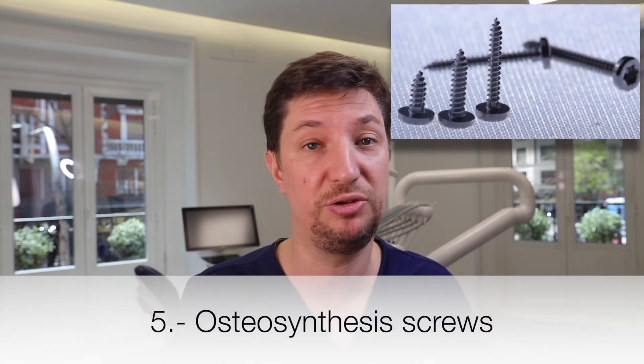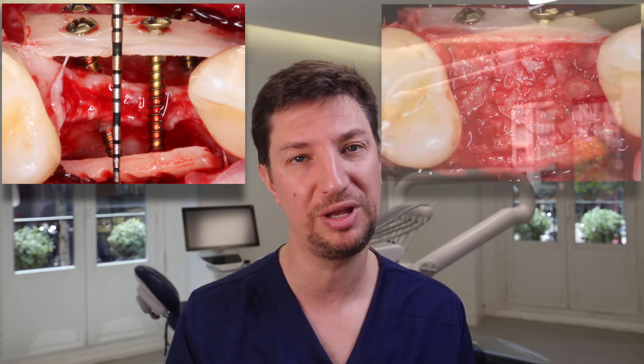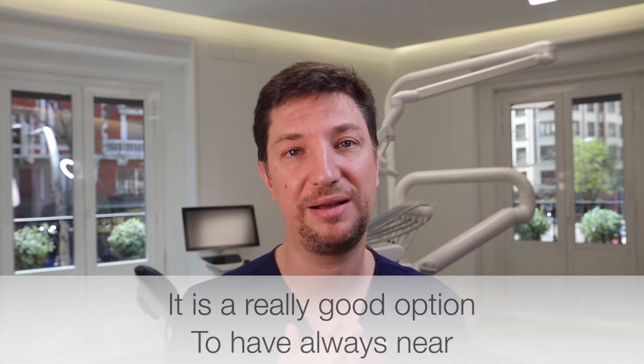The fifth way of fixing our bone grafts is with osteosynthesis screws. These are really trendy nowadays — we can use them for almost everything, including holding membranes instead of pins to keep them immobilized. You don't need to remove titanium screws. They fix bone plates very firmly, giving us excellent immobilization of the bone graft. We encourage you to always have your osteosynthesis screw kit in the clinic — for example, if you're removing a tooth and the buccal plate breaks, you can fix it easily with a couple of screws.